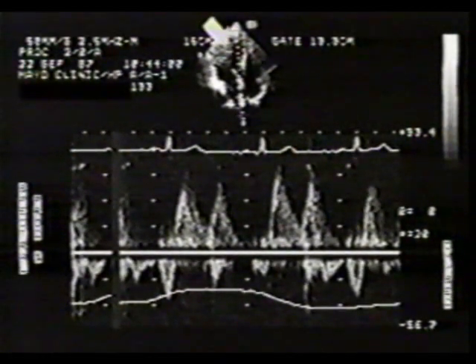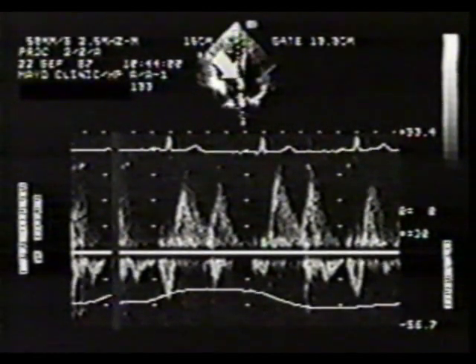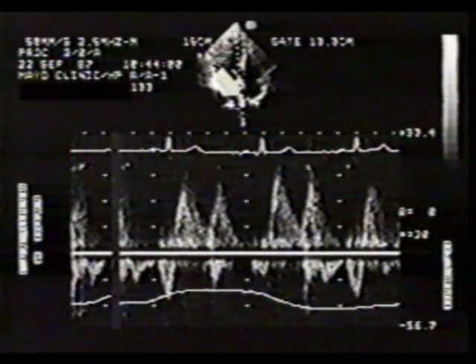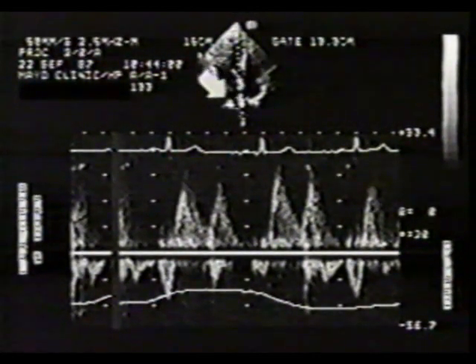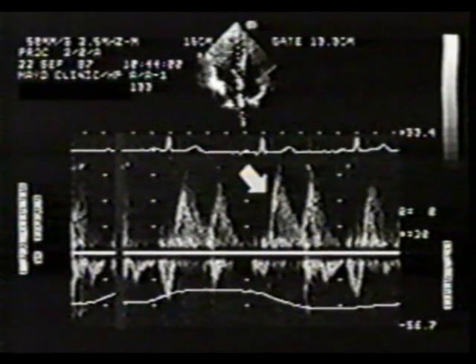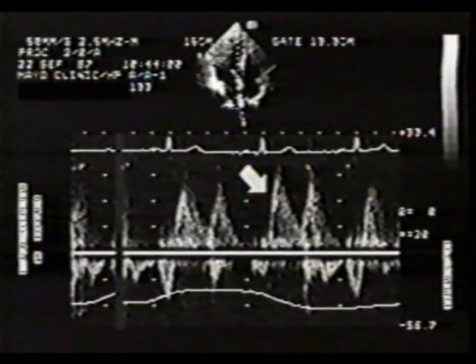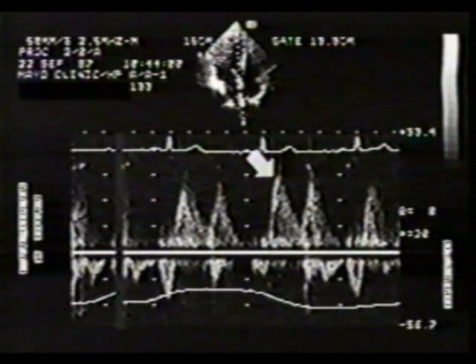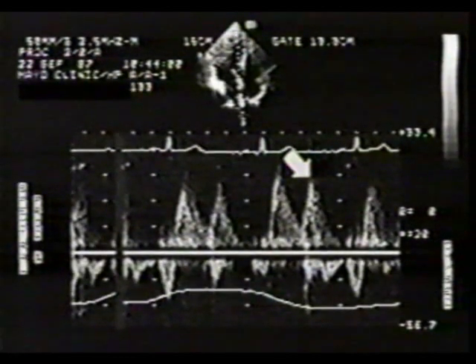This small four-chamber view has been used to guide a Doppler cursor along the left ventricle and left atrium. The sample volume has been placed at the ostium of the right paraseptal pulmonary vein. The normal pulmonary venous flow is characterized by two prominent antegrade flow peaks and a smaller peak representing retrograde flow. Note that the antegrade flow has a systolic and a diastolic peak recorded above the baseline, each about 0.6 meters per second.